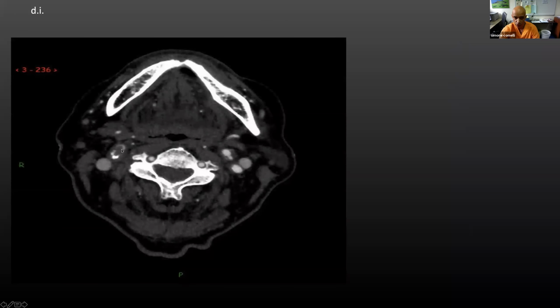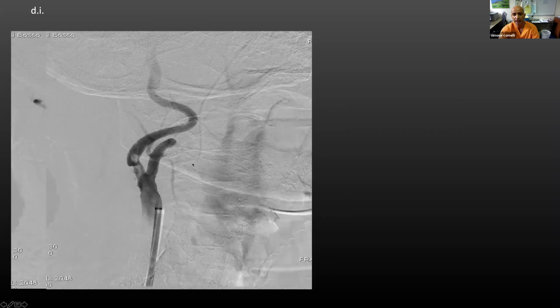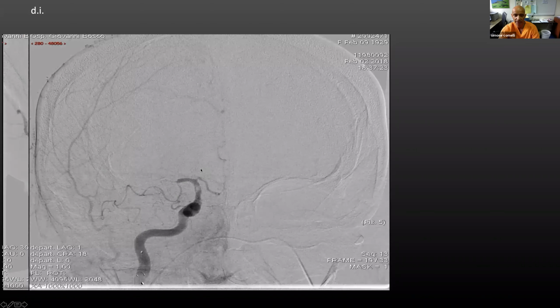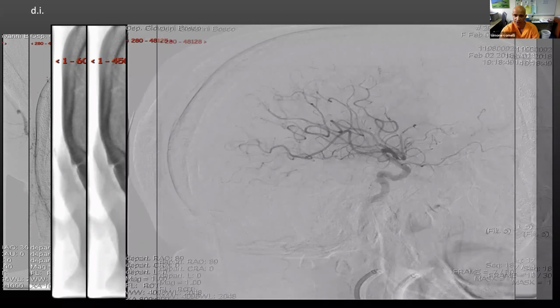This is another case with a thrombus again. You can see the hypodensity at the bifurcation. I thought the same, so we decided to work in the same way. We passed the obstruction. You know how unstable the thrombus is here. We decided to pass with the filter. We aspirate, we suck the thrombus, but we ended up with a thrombus in the ICA and the M1 segment. But we were there, and so it was so easy just to get there and to suck the thrombus and to obtain the reperfusion of the Sylvian system, as you can see here.